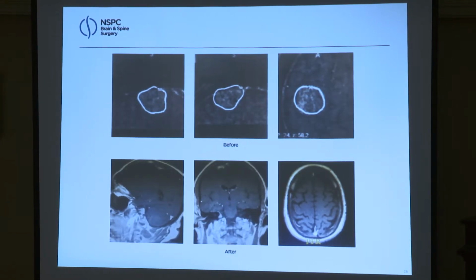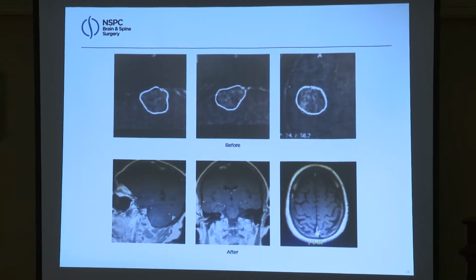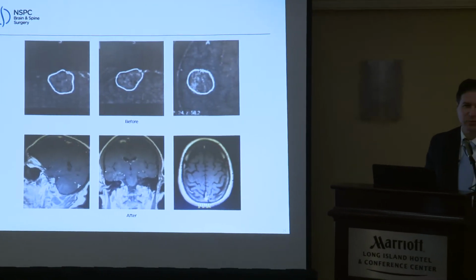So this is the next category of benign diseases, meningiomas. And again, certainly somebody who has a 7-centimeter tumor with shift and they're herniated, of course you're going to operate on them. But a lot of these we're finding smaller, it's not too big. And one of the key features about radiosurgery, when I say, is it a who, what, when, where, why, it's a when. What is the time frame in which you've got to take care of this problem? If you have time, you can do a lot of things with radiosurgery.